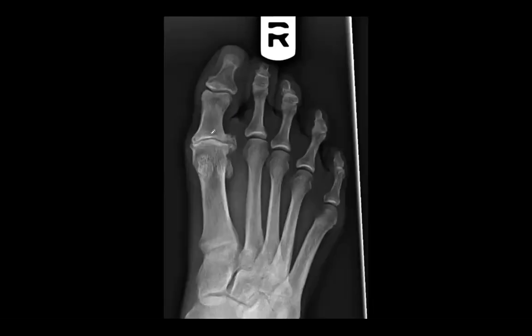Oh. Here's an example we looked at earlier. I just want to show one of a DASA that's abnormal, where you would come like this and you see the intrinsic deformity of that phalanx.